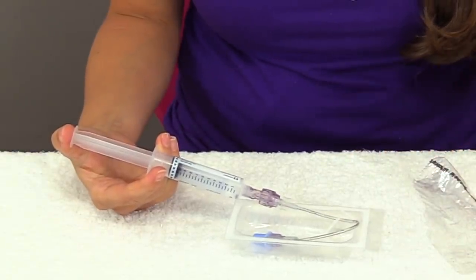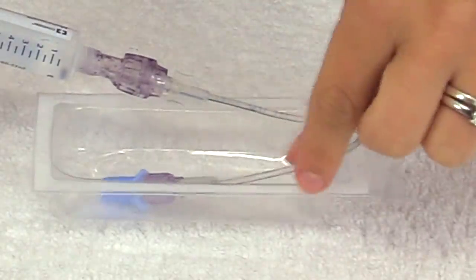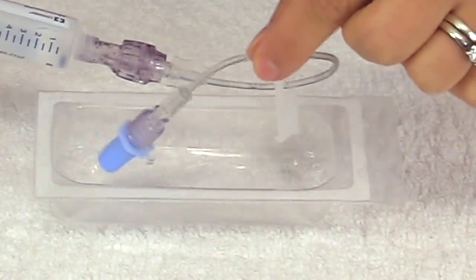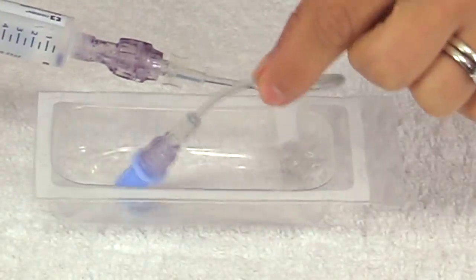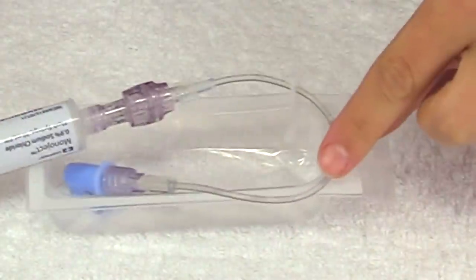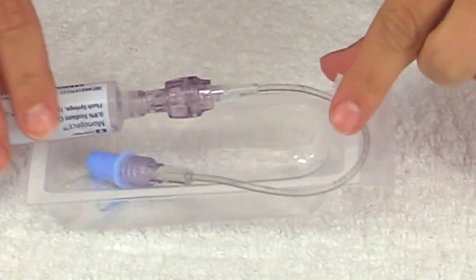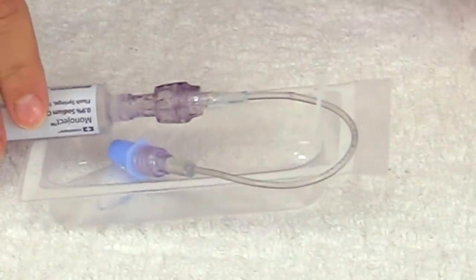Then I'm going to inject the saline into the tubing. How I know that all the air is cleared out — I'm going to watch it go through and then watch it drip out into the packaging. As you can see, it's filtering through and we have enough. So I'll just leave that there and it is ready to go for whenever I'm ready to start the IV.